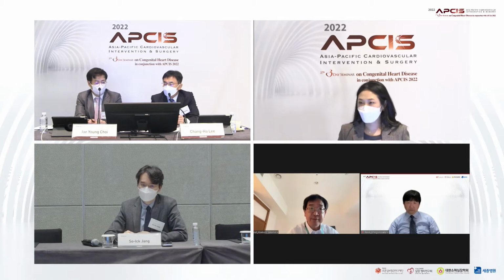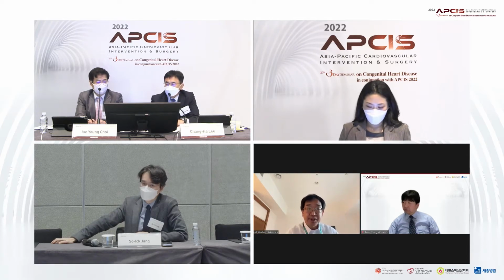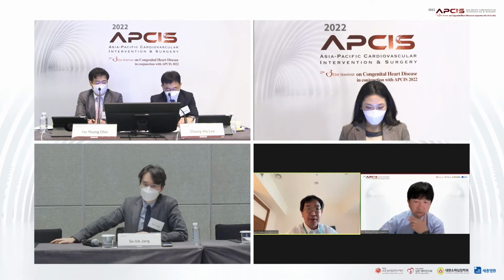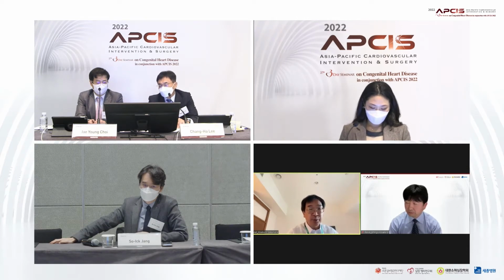So we can safely insert the stent or larger balloons. Thank you very much. I also agree to use the stent, but together with body weight growth and time, we will need to redilate the stent.